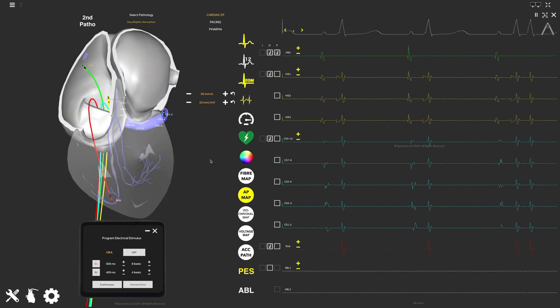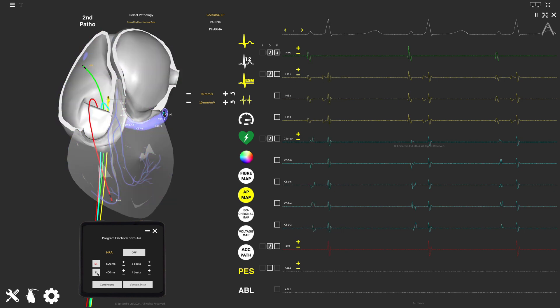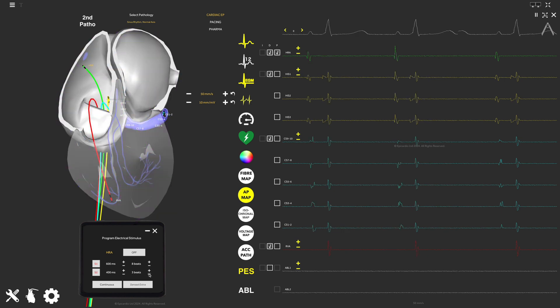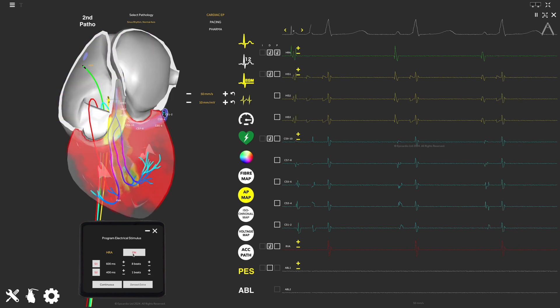The program electrical stimulus window allows you to control the pacing. You can use the controls in the PS window to set the pacing protocol and click on-off to start pacing.